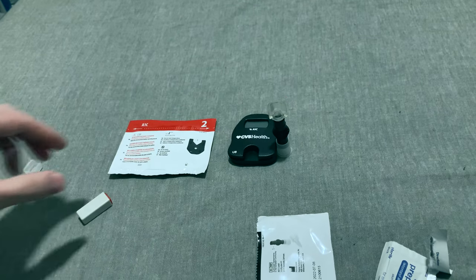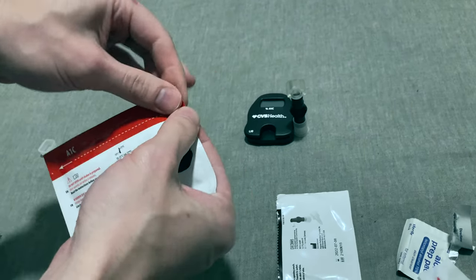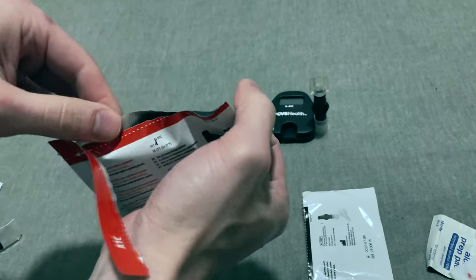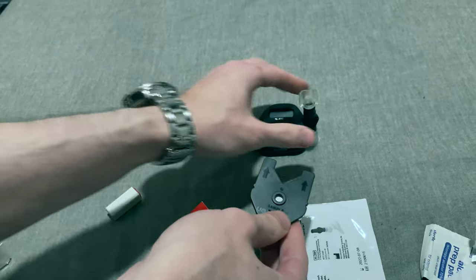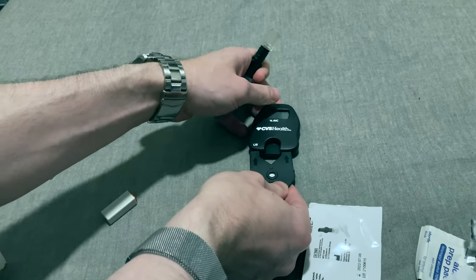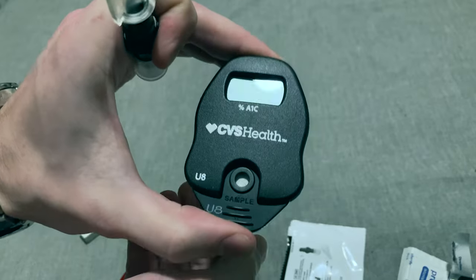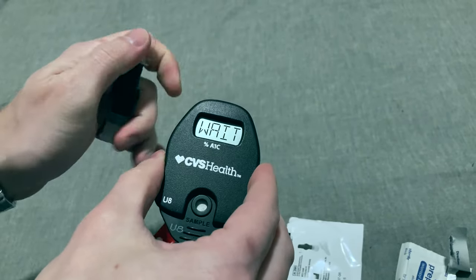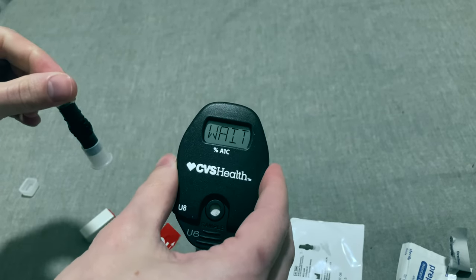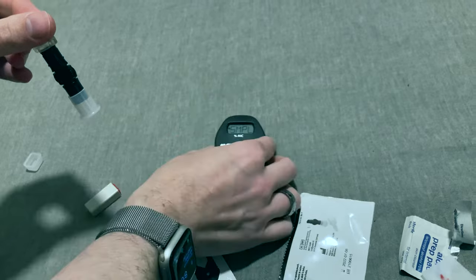All right. Now we're going to take the cartridge out from the second pouch, and carefully insert it into the machine. And it makes a click. Like that. Now you see on the display, it says wait. So we have to wait and it'll say it's ready for the sample.